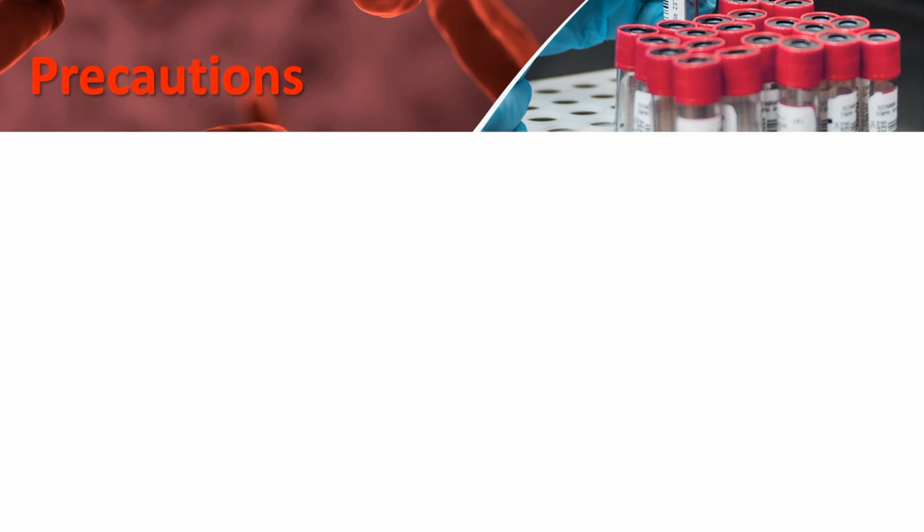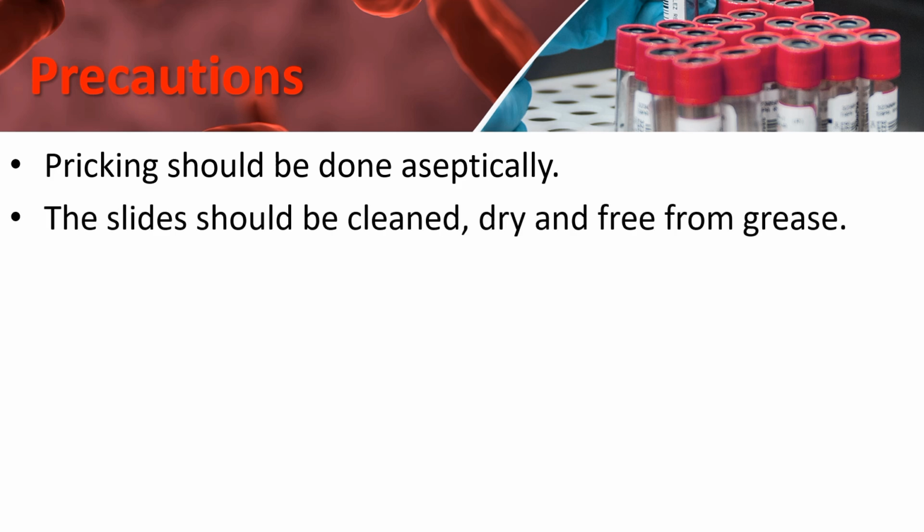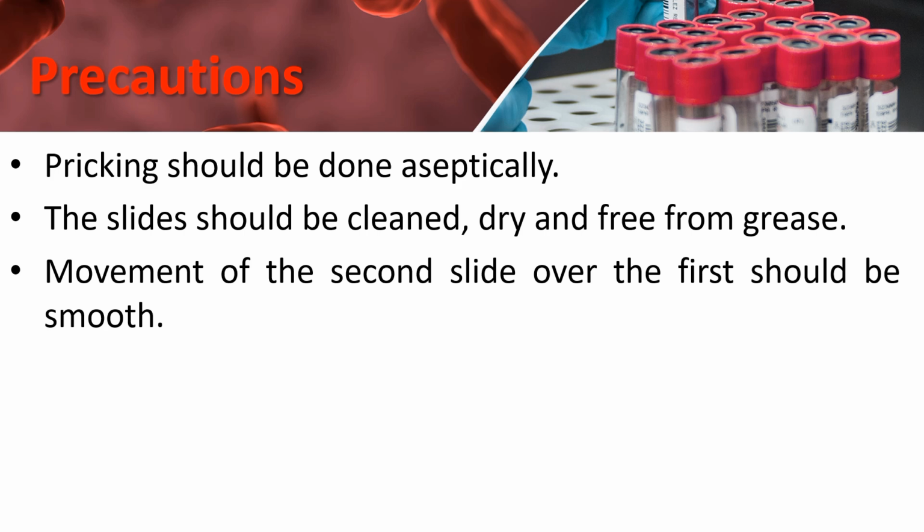Pricking should be done aseptically. The slides should be cleaned, dry, and free from grease, and movement of the second slide over the first slide should be smooth.